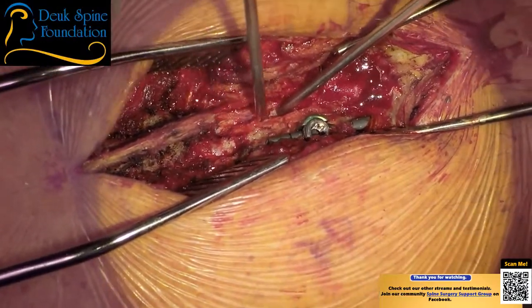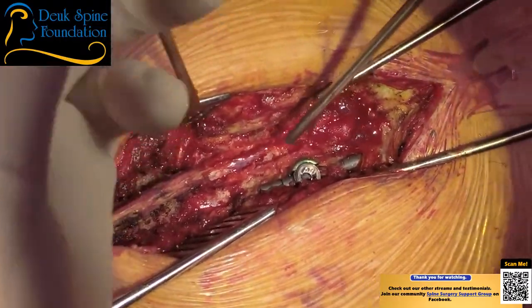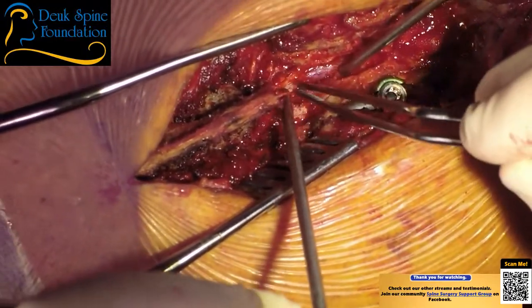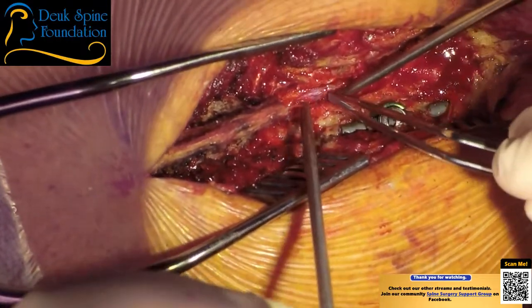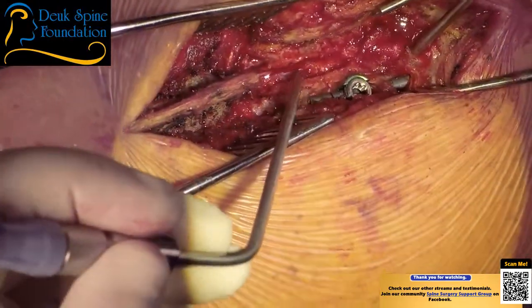Yeah, I understand. All right, gel foam. Please look at the dura, guys. Just look at the difference. It's pretty crazy, huh? I mean, you can see right here, it's pretty much white, right? And right here, it's pretty much red. That's from the compression and the inflammation from those facet joints. Let me try to open this a little more first.